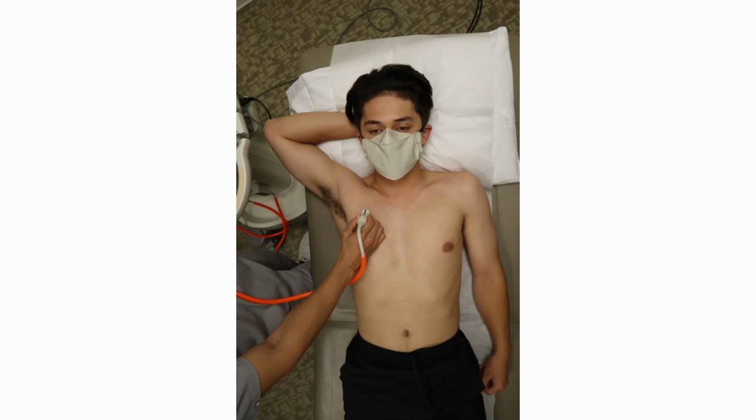So as I mentioned before, we're discussing the EFAST, and the way we get an EFAST is we add the lung views on to evaluate for pneumothorax. This is best done with the linear probe, but you can also do it with a phased array probe, really any probe, but just the superficial linear probe is best for this. And you're trying to get between the ribs.